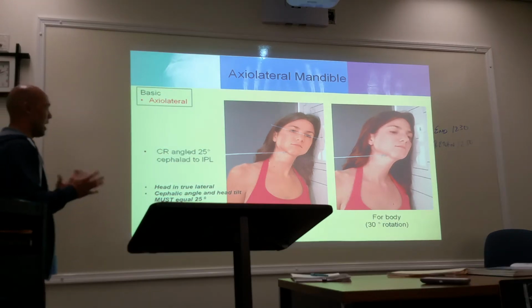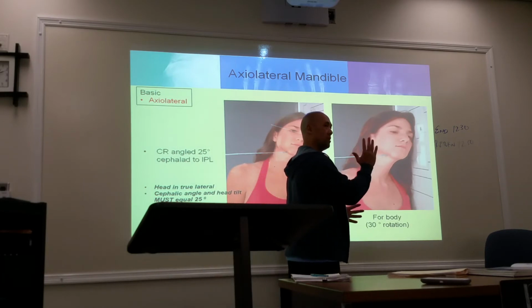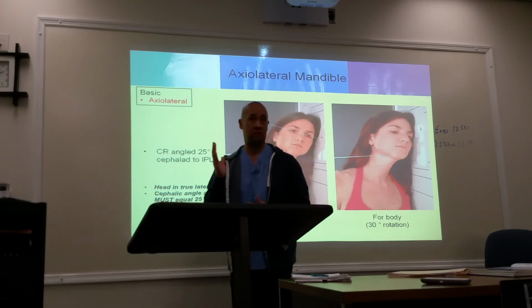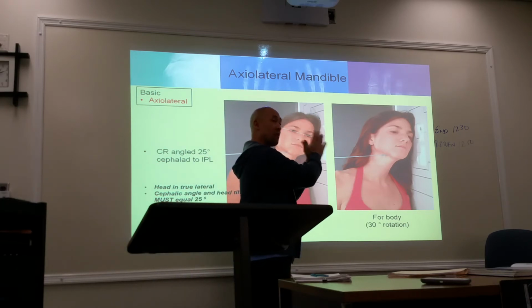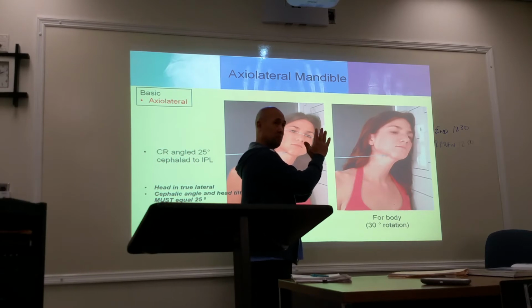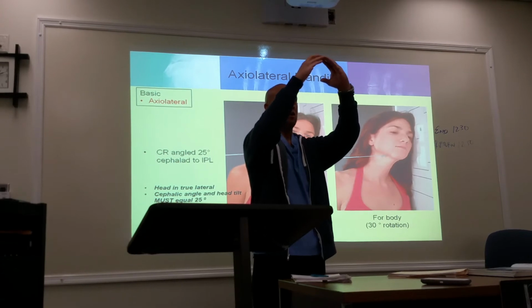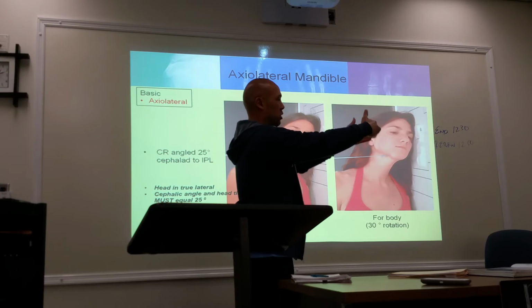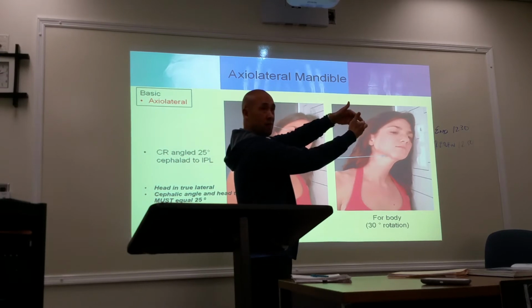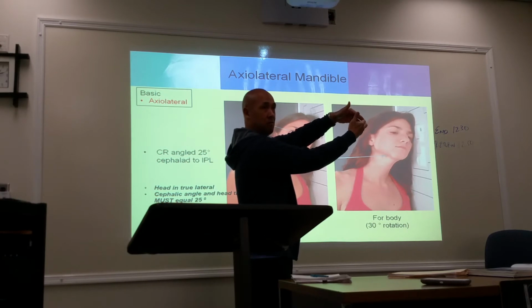So an axial lateral mandible. If you place the patient in a true lateral position, you're going to get superimposition. Okay? So the body and the ramus will be superimposed on top of the other body and ramus in a true lateral position. Your jaw, or your mandible, is an arch, or an arc, however you want to call it. So what we're trying to do is open it up so you can visualize both body and rami. Does that make sense?